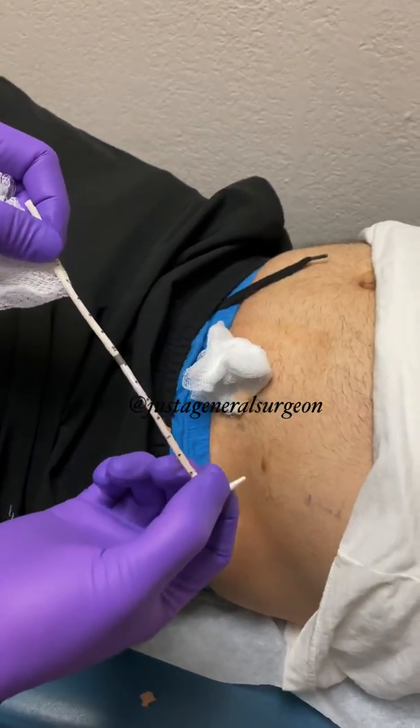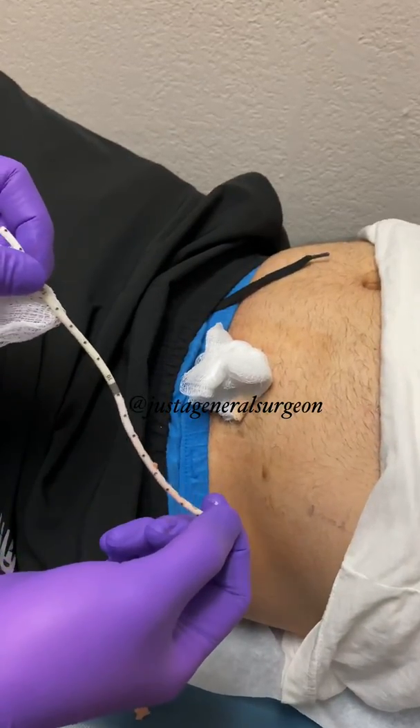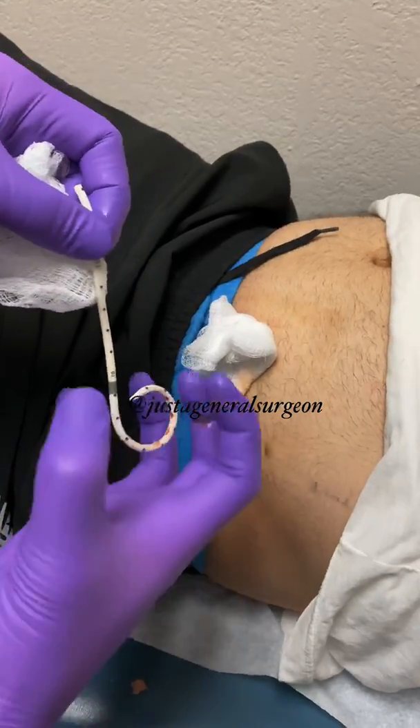When I cut that stitch, it allows the drain to unfold. So when it's inserted, it coils up — that's how it fits into a little abscess space.